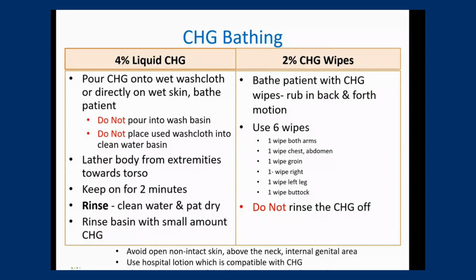A lot of patients will say sometimes they'll feel a little sticky, but that should go away in a little bit. And then also you can speak to your patients about what lotions they have. Some lotions that are coming from home aren't compatible with our CHG, so you want to discuss that with them, and they can always use the hospital lotion.